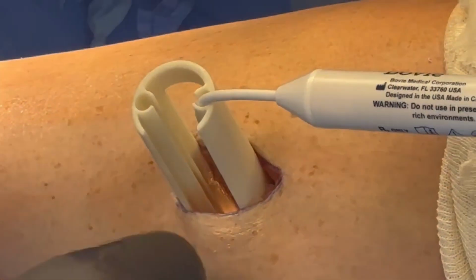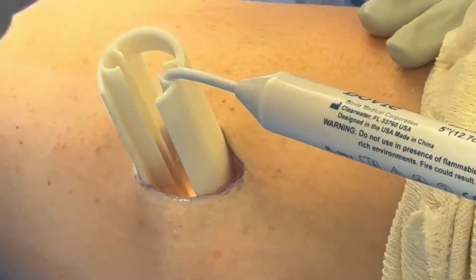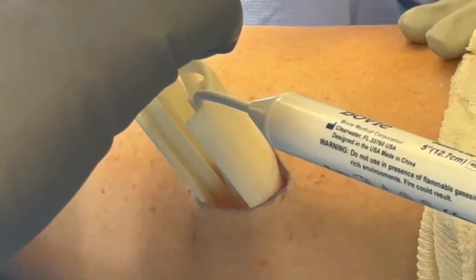So you can see the light in there and the white, shiny, soft tissue that you can see dorsally and plantarly. Dorsally is going to be the soleus fascial layer, and plantarly, which isn't a great view right now, the plantar aspect, or posterior aspect, would be more the gastroc fascial layer.